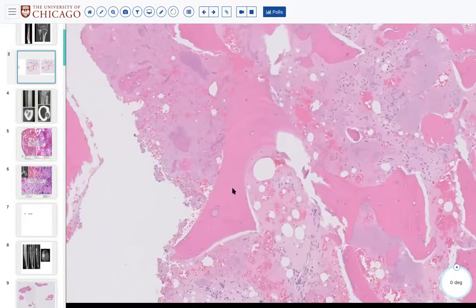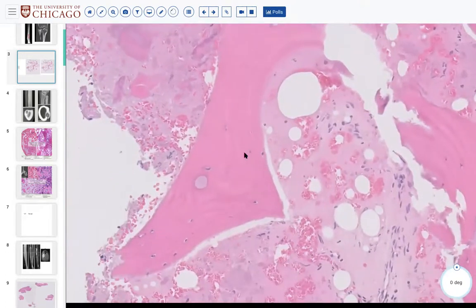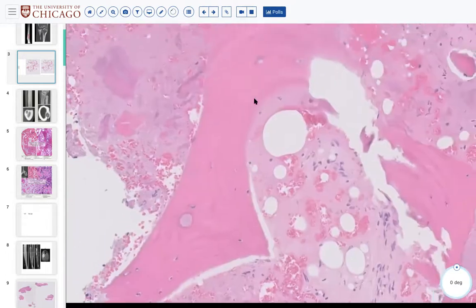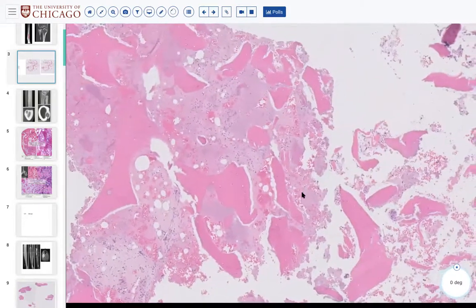This is bone trabecula. This is bone. Thank you. If nobody talks, I'm just going to start really basic. So you all better speak up. So this is bone. Is this lamellar bone or woven bone? It's not woven bone. Nice lamellar bone. Exactly. It's got beautiful lines running through it. The osteocytes are very small, and I do not really see osteoblast rimming. So what does this imply?